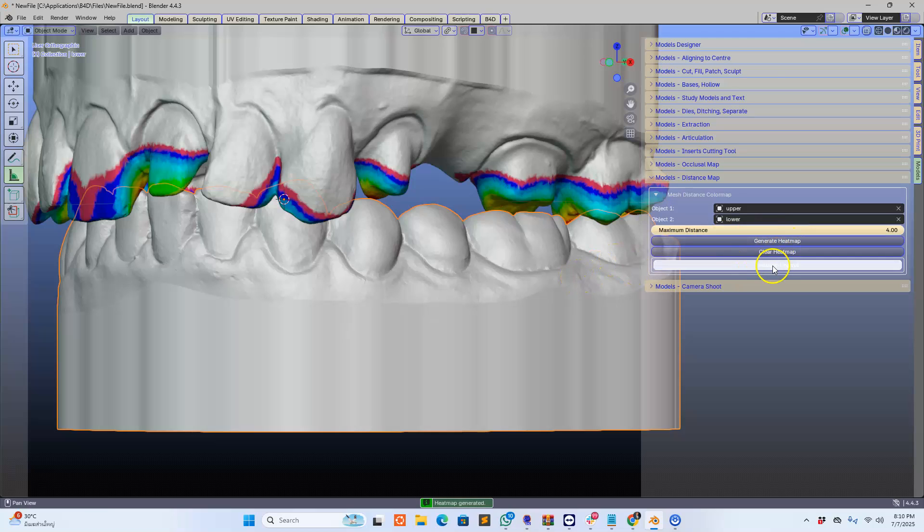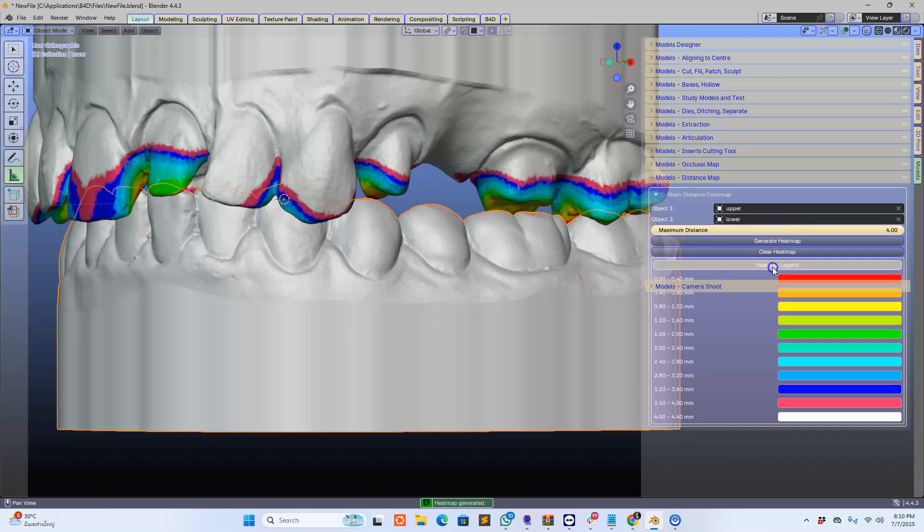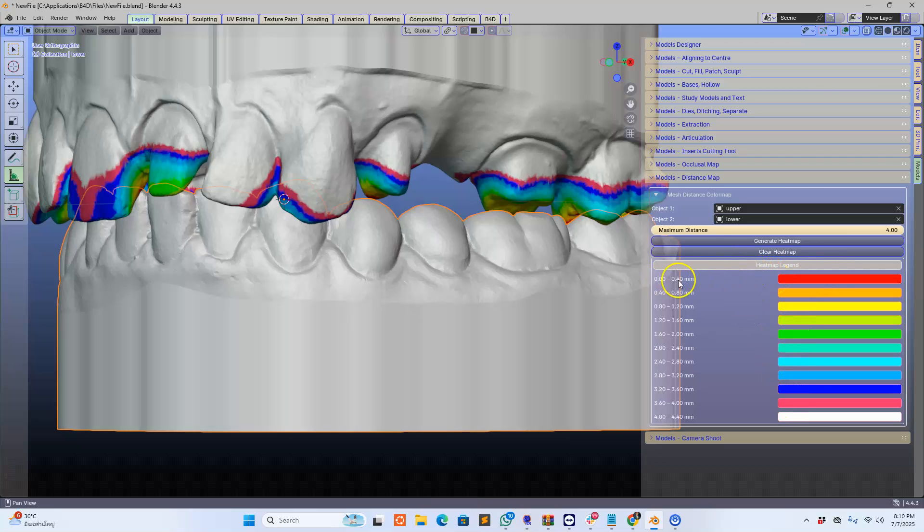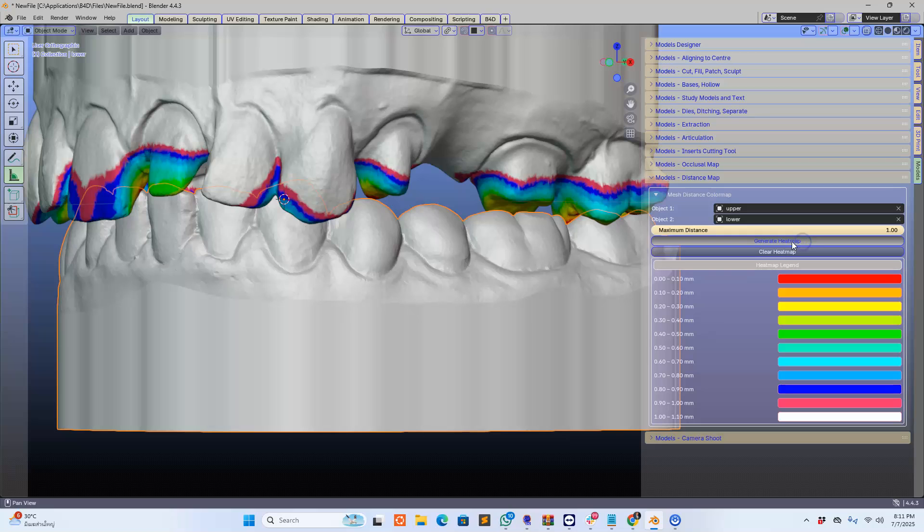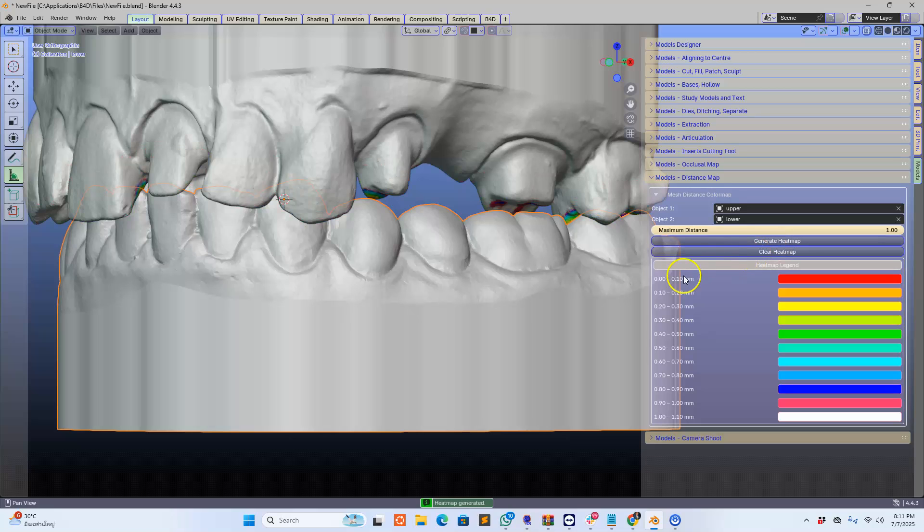So the beauty about this is that we've got this heat map legend with all the colors. As you can see, the heat map distances have changed according to the maximum distance. I'll just put this to one and then generate again, and you'll see exactly what I mean.